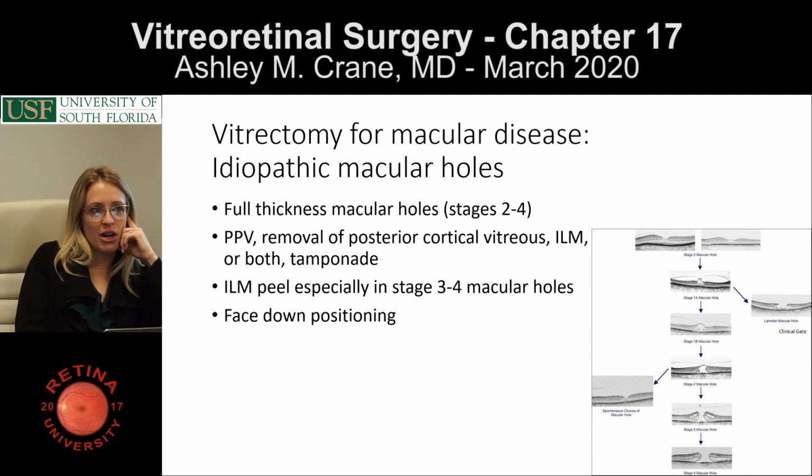There are some studies. One study got OCTs through the gas bubbles very soon after surgery, and almost everyone who was going to close had closed within 24 hours.